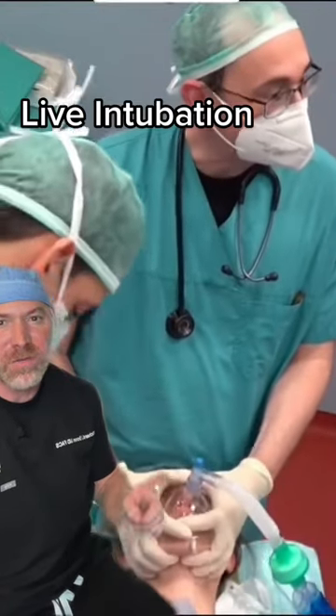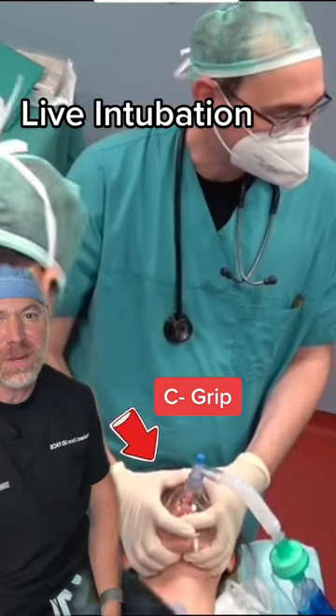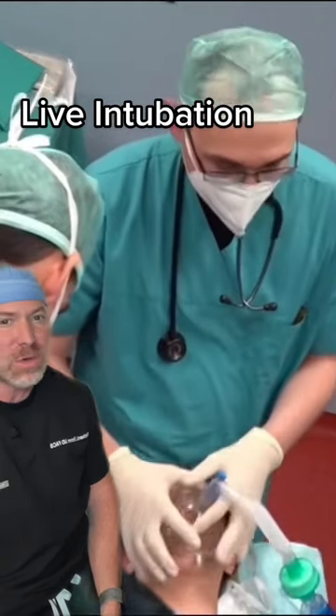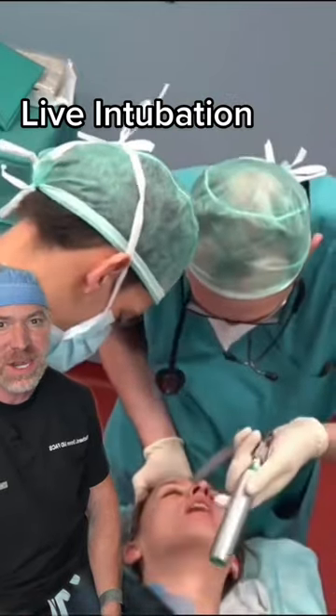All right, a live intubation. Here we go. First, the anesthesiologist has what's called a C-grip. He's doing a jaw thrust to open up the airway, and he's pre-oxygenating with 100% oxygen here, because there's a small time period where the patient's not breathing. She's already asleep, she's had her medication.